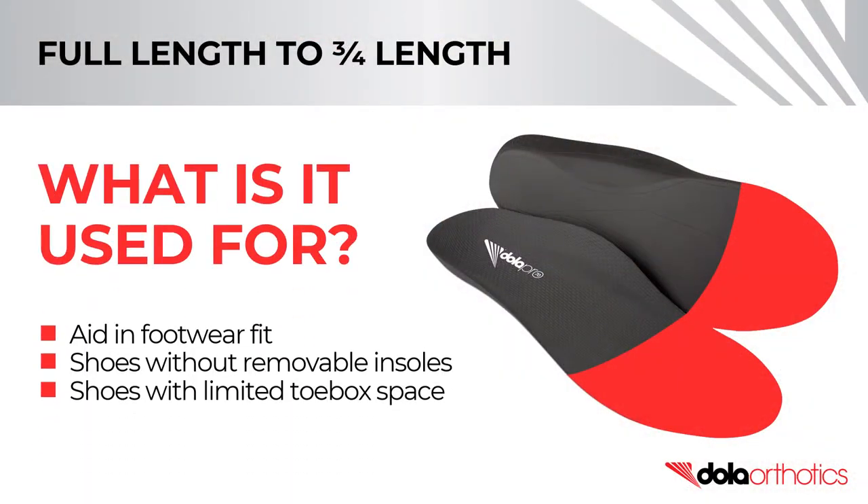The modification of a full-length orthotic to three-quarter length or sulcus length is used to aid in footwear fit, including football boots, cycling cleats, ski boots, dress shoes, high heels, street shoes, and narrow-waisted sport shoes, and for shoes with a non-removable insole where the toe box space may be limited.